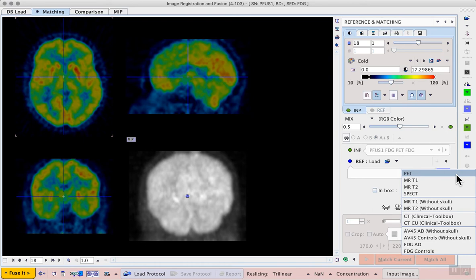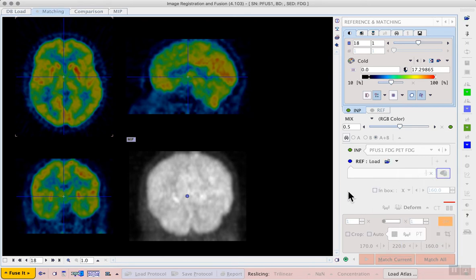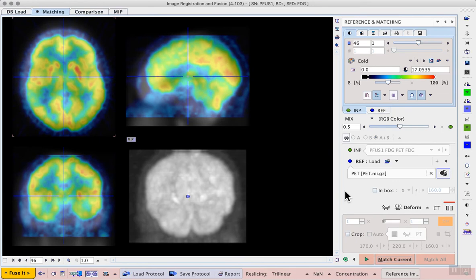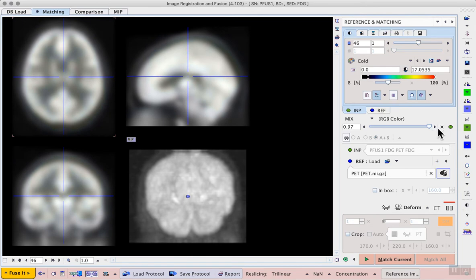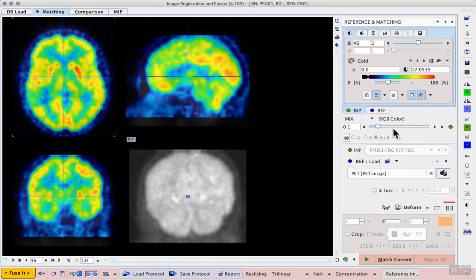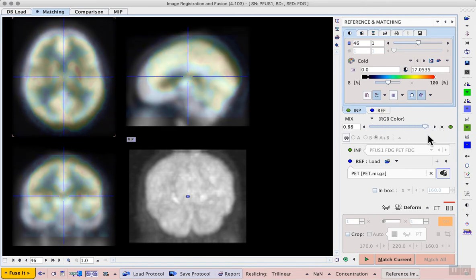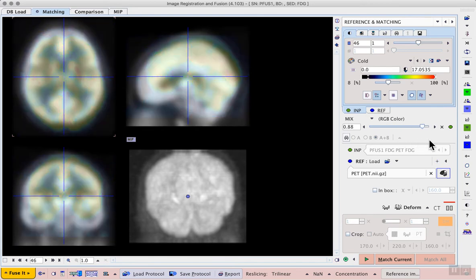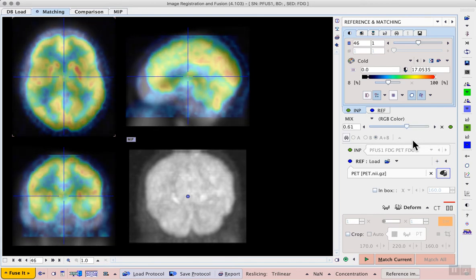In this case we have an FDG PET data so we can select the standard PET template from the top of the list. That loads the template and now we can use our fusion controls as before to examine the template image and our individual. We can see not only is the shape different but we have quite a translation difference between the two.